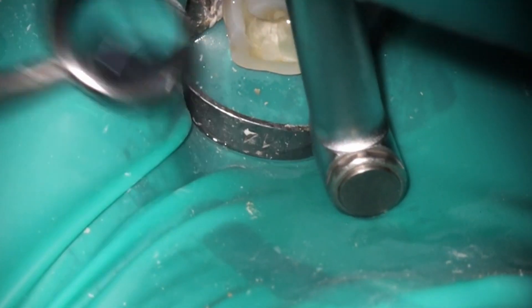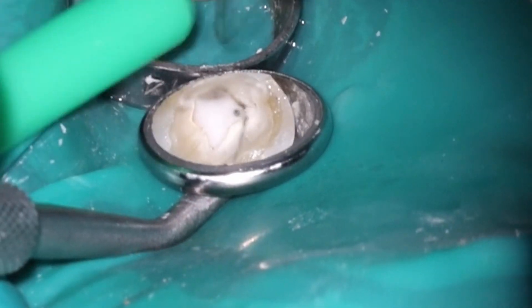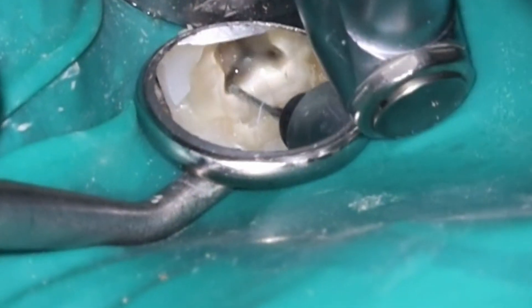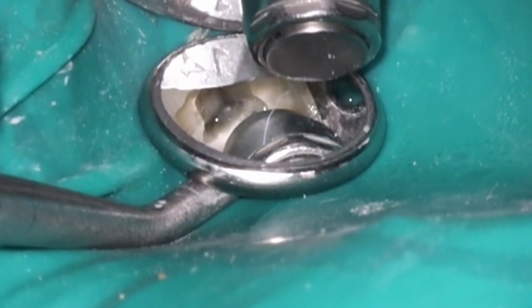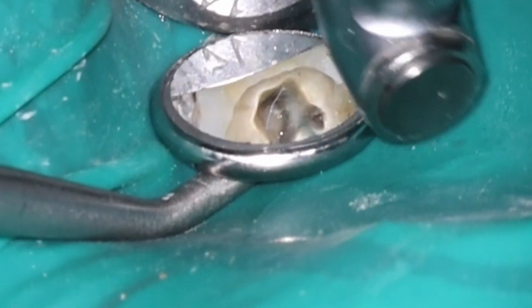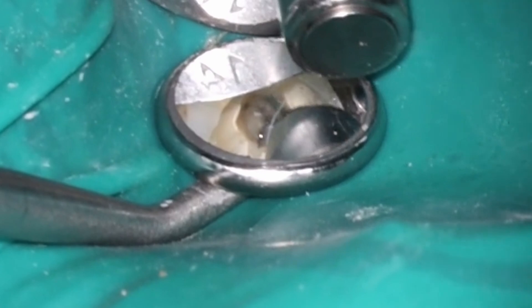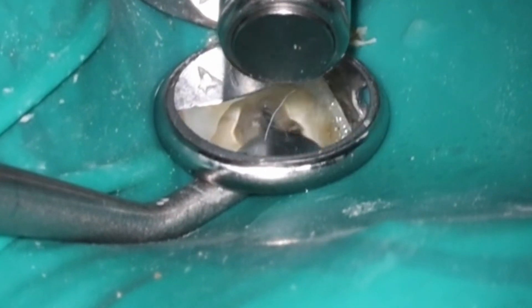You can see me actually going down past the stopper. It is a good trick when getting used to your files: the way they design it, the area where the stopper is is right at 21, and then you'll have those color stripes on top — oftentimes that's another millimeter. So you can be a little bit crafty and get down to 22 with a 21-millimeter file without having to get out the larger files. I do this a lot with upper molars — the palatal canal is often two or three millimeters longer than the buccal canals, and you can actually get it all done just with the 21-millimeter file.